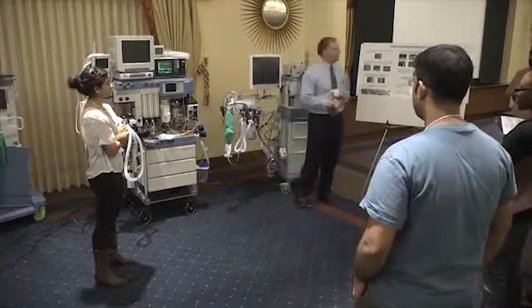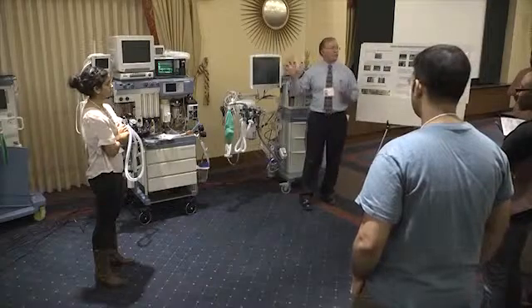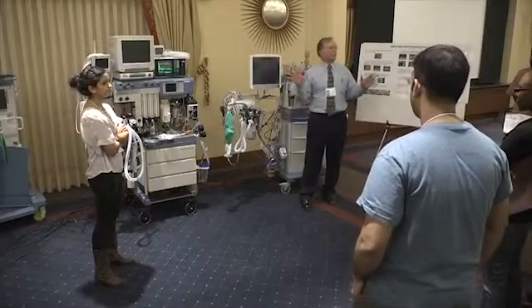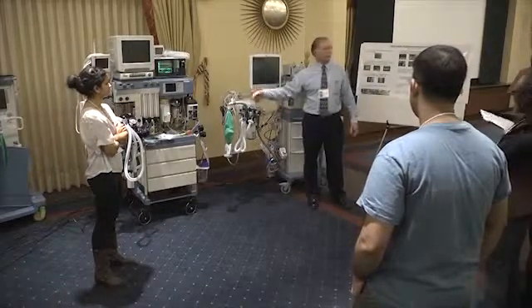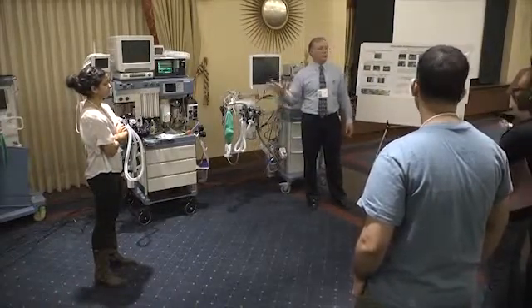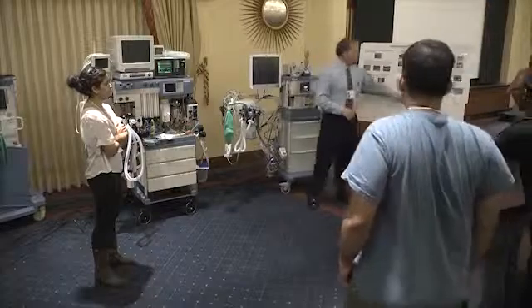So be wary of your monitors. Try to turn them on, look at everything, glance around the room, and make sure everything's good. Verify patient suction. Just click your regulator on and make sure you have patient suction. That's a key item.